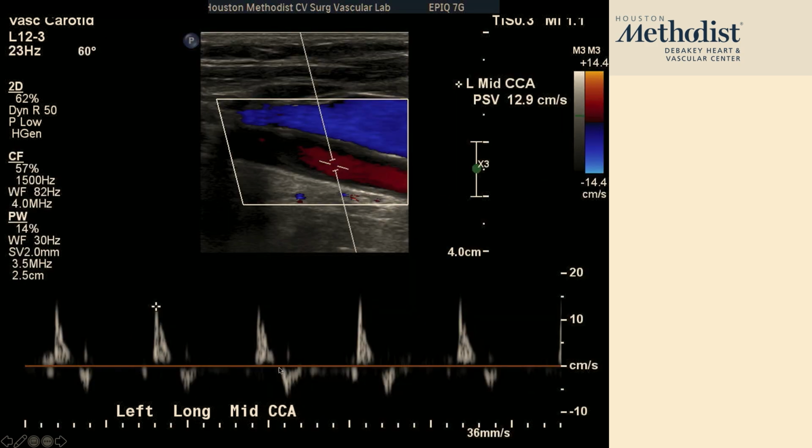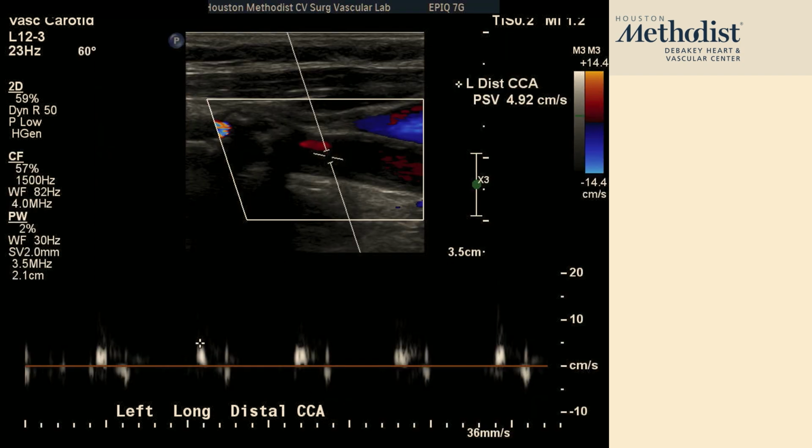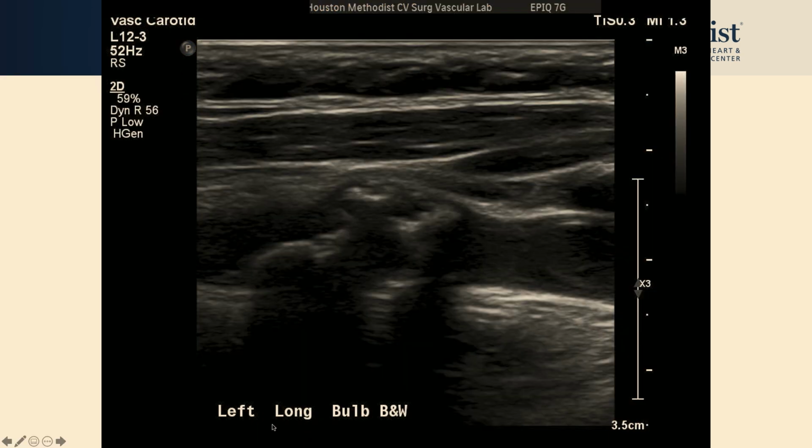This extremely high resistance waveform indicates that downstream, distally, you may have an obstruction. You don't have any diastolic flow, and compared to the previous images from the other side, that tells me, because in my brain I'm non-stop comparing what I saw on the other side, it's reminding me of a minimal to-and-fro flow signal in the distal CCA, hitting the wall and bouncing back. Sometimes we just call it a wall motion artifact when you see just this thump. Maybe it's not much of a flow signal. You see a flow signal a little bit higher up, but maybe this is just a wall motion artifact.